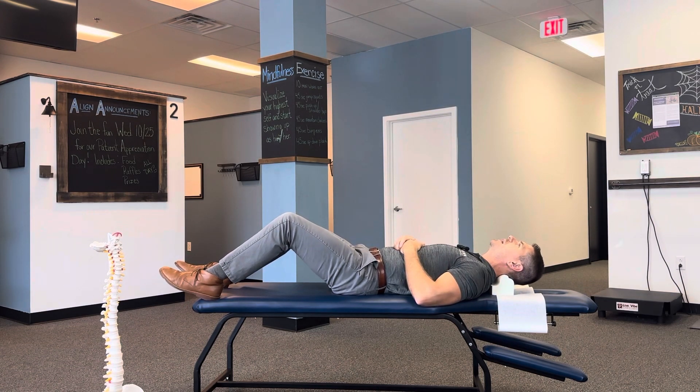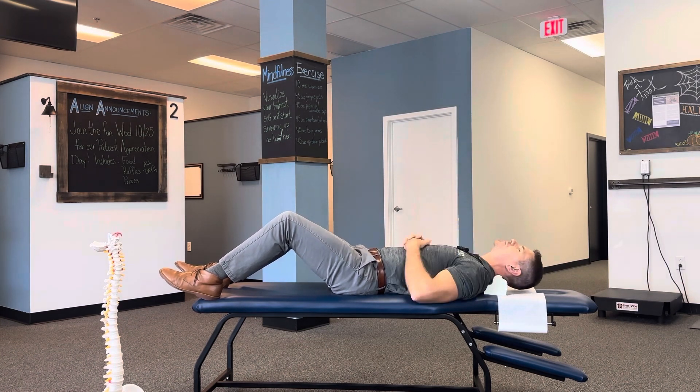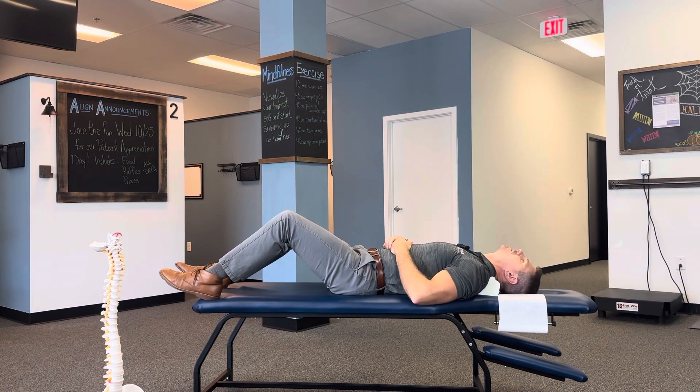If I say to put it high, you're going to put it underneath the base of the skull and just lie down and relax. If I say middle, position it in the middle of the neck. If I say low, put it as low on the neck as you possibly can — just like that.